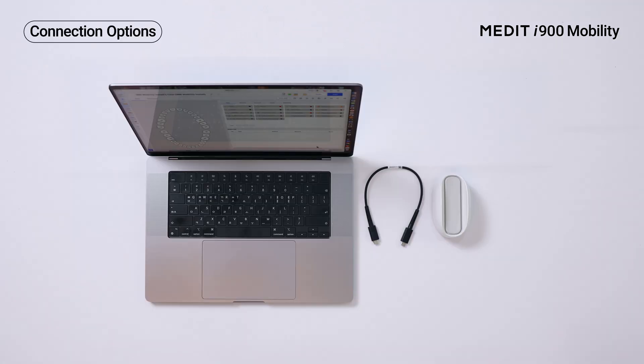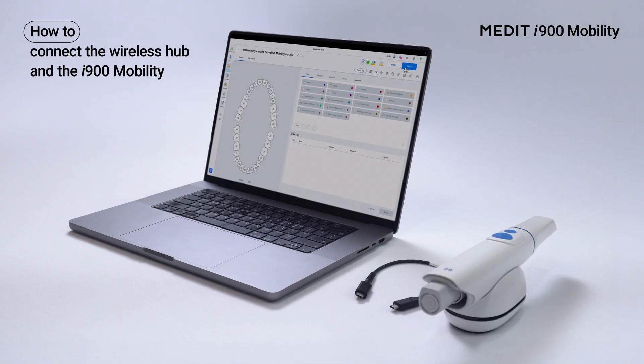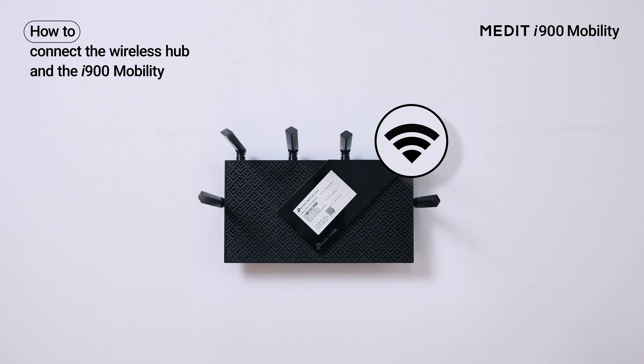You can connect the Medit i900 Mobility either with a wireless hub or without a hub using a Wi-Fi router. First, let's set the wireless hub that also works as a desktop cradle. We recommend this when using a router is difficult or restricted.